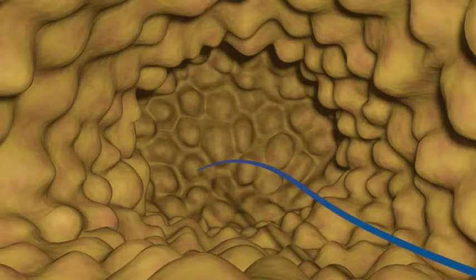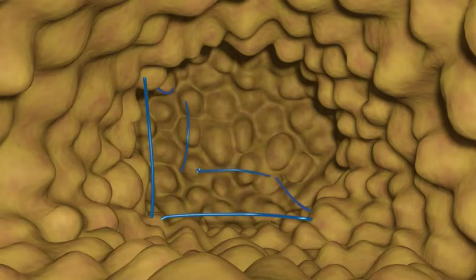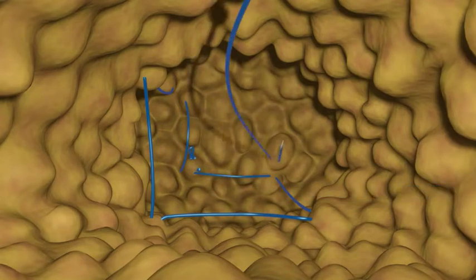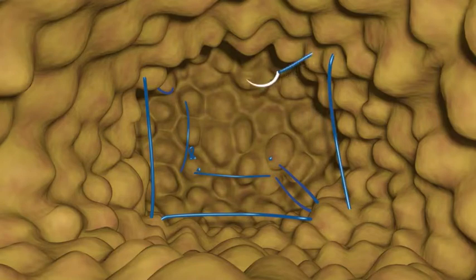Here we see an L-shaped placement, which I quite like. In the diagram, the L shape is placed into the lumpectomy cavity such that one L touches the posterior all the way to the anterior margin along the lateral and inferior edges. The second arm of the L touches again the posterior to anterior margins along the medial and superior margins.